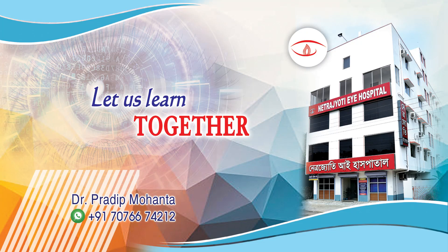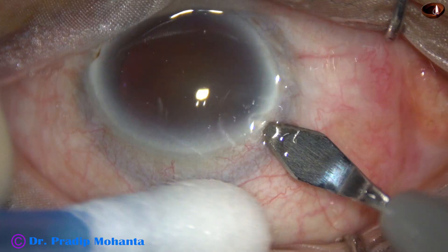Friends, welcome to my workplace at Ranaghat, West Bengal, India. Let us observe management of this very hard cataract.